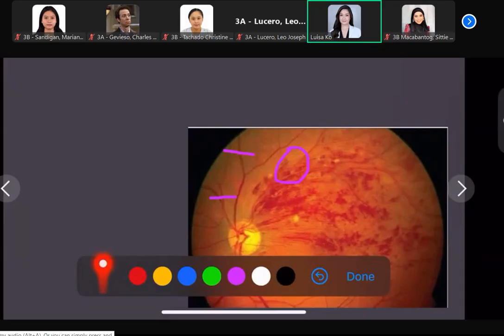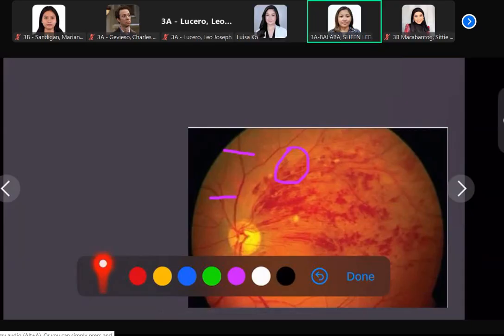We agree? Yes, Doc. Okay, good. So you look at the second branching of the artery in comparison to the vein, just how thick it is compared to the vein. Normally it looks similar, or a little bit close. So it's a grade of 2 versus a grade of 3 for your vein.